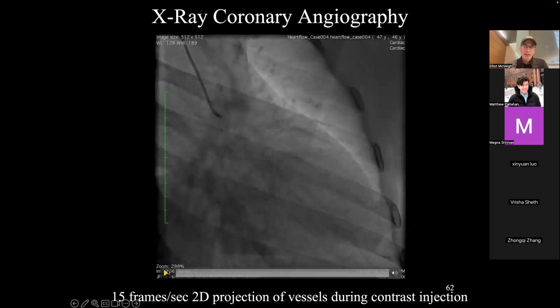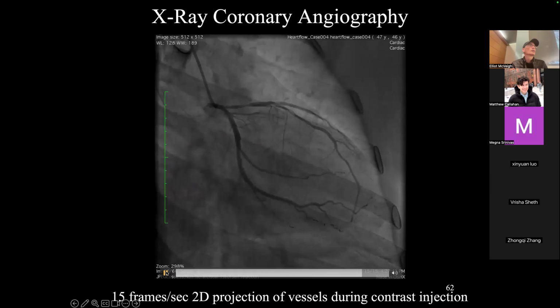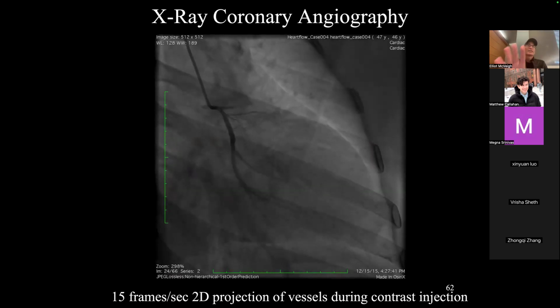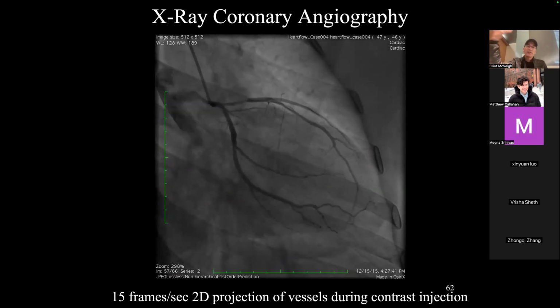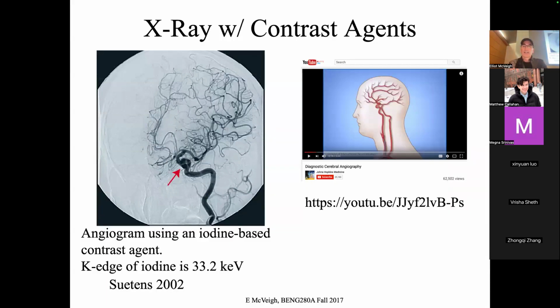And then here I think I showed you this before. This is like Hypaque, which is a contrast agent that goes straight into a vessel and causes a lot of shadow because the mu value is very high, right? Here's angiography in the brain done at 2 energies. So you take 2 images and you inject this contrast and subtract them, and then all you have is the vessels.